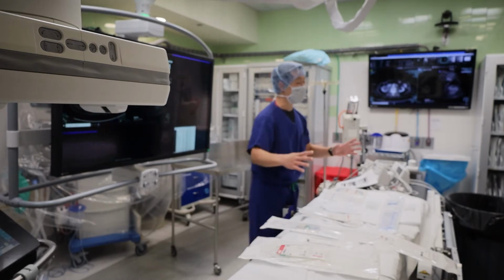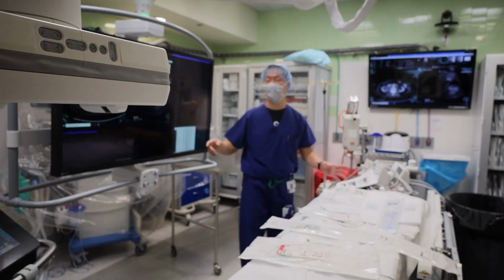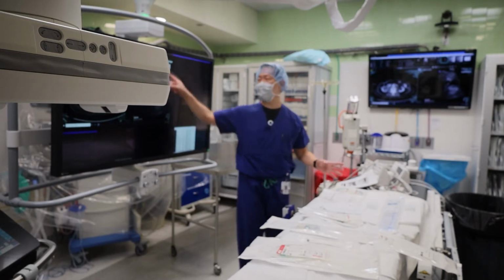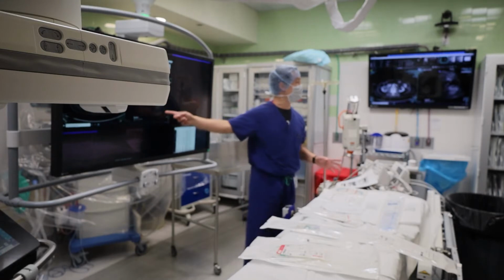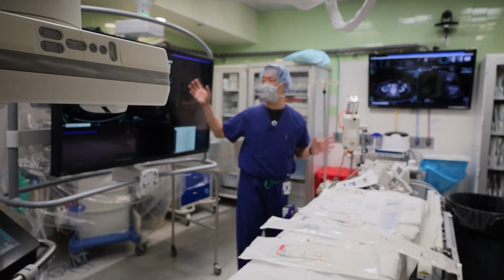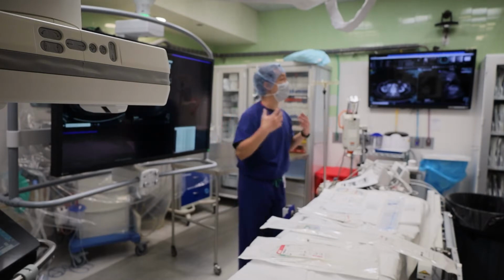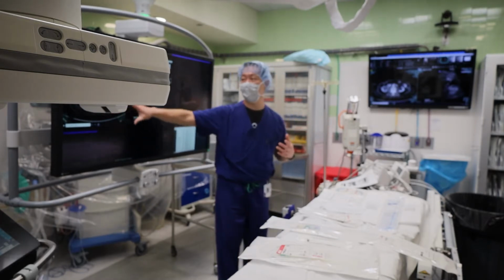Once you drape and everything, nobody wants to move the drape, and then now the window's only that big. And when you're scanning, it's like, I think that's a kidney, but I didn't scan around here and here, so I don't know if maybe this is bowel or some other organ, right? So that's why scanning is really important, and we cheat because we look at this in advance, so we kind of have certain landmarks, okay?